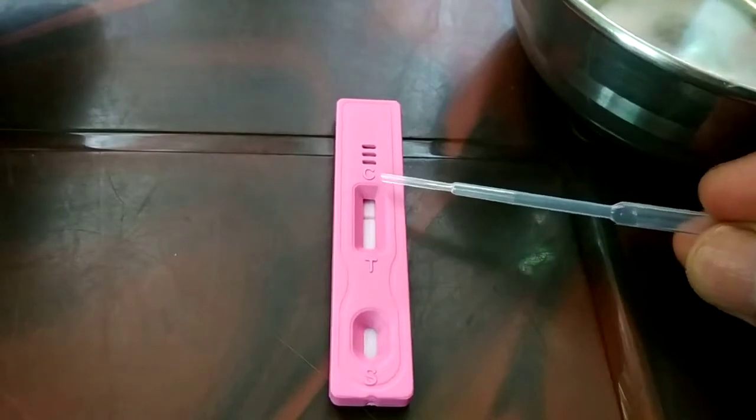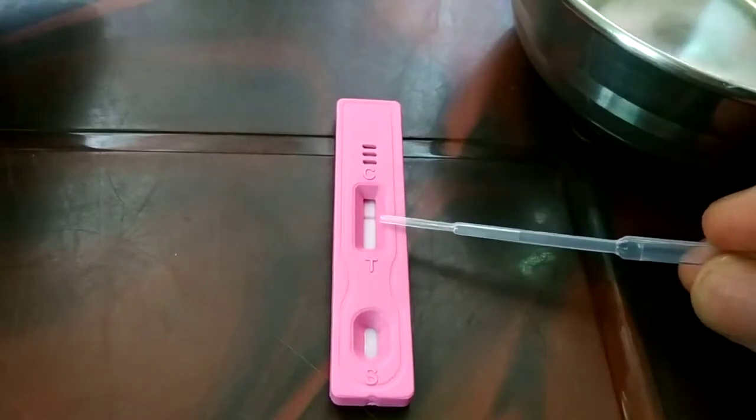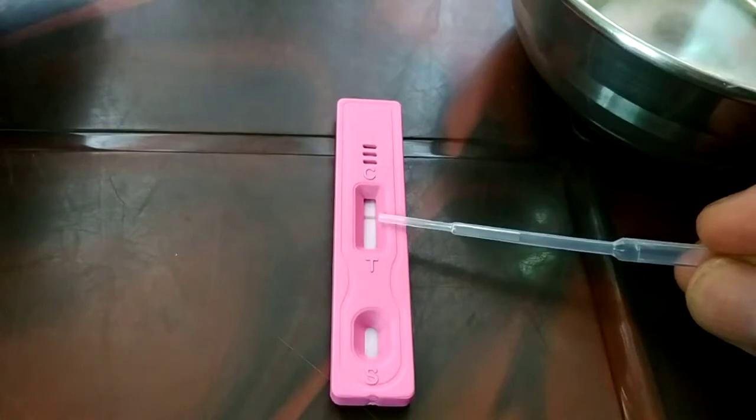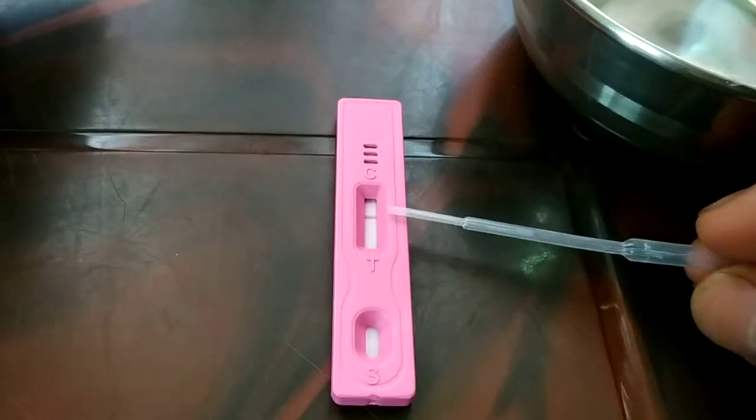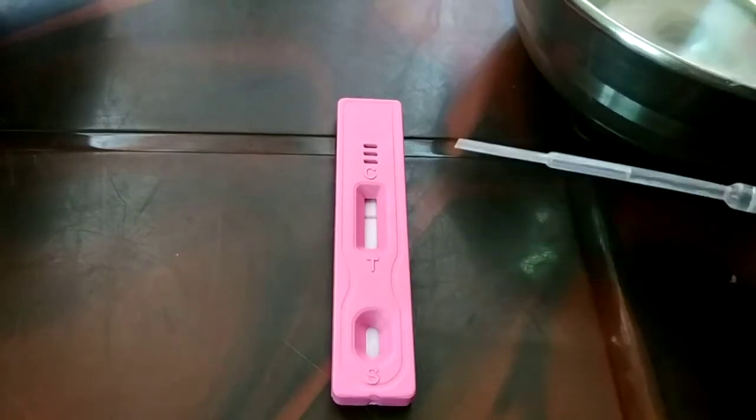Here it is the C — you can see the letter C, and here I got a dark line. This means the result is negative, which means the particular person is not pregnant.